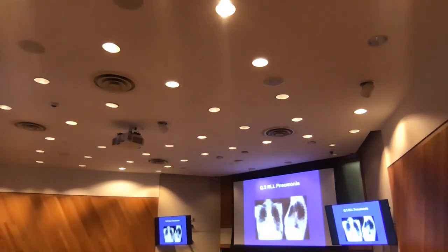Left lower lobe pneumonia, right lower lobe pneumonia. It is in the lower part, where the lower lobe is. I showed you the lower location, right? And you can see it against the spine, so is it right or wrong? Yes. Is it also on the left as well? No, on the left the structures overlap each other, so we don't know.